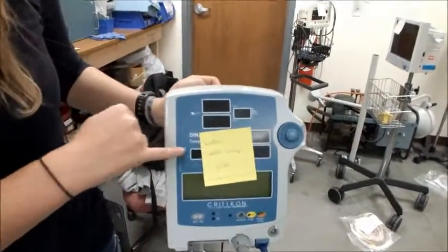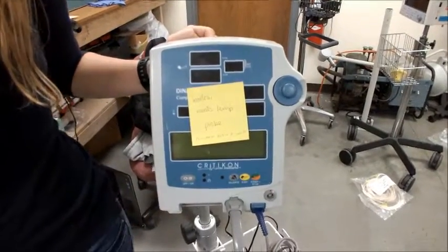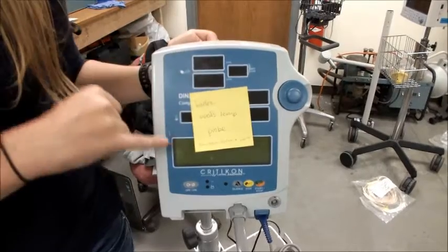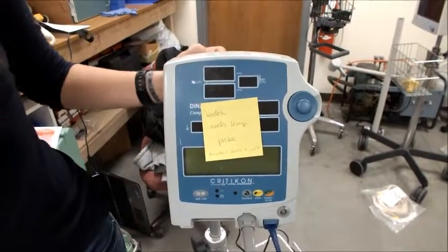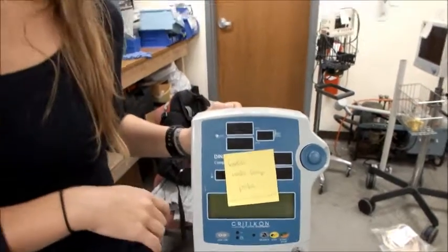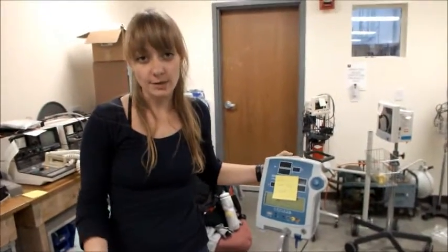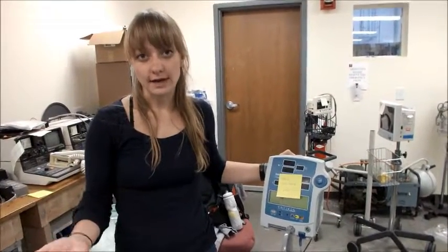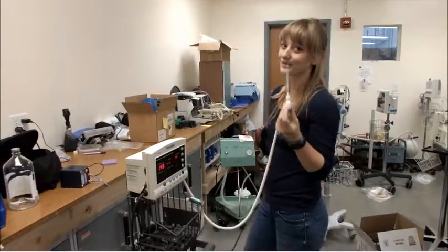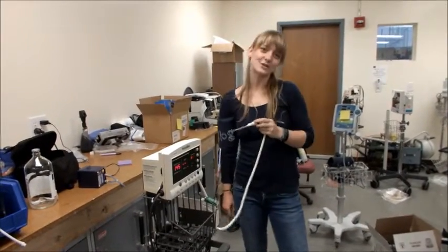Sometimes you might have other malfunctions. For instance, this machine apparently needs a temperature probe or its printer isn't working. If that's the case, leave a sticky note like this on the front of the machine or the front of the box, and then take it back to where it came from. If the machine never turned on or is broken in some other way, also leave that sticky note on the device and return it to where it came from. Now you've tested your machine and you're a blood pressure machine expert.